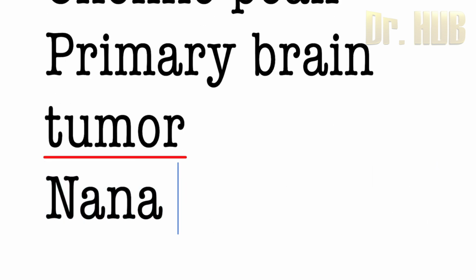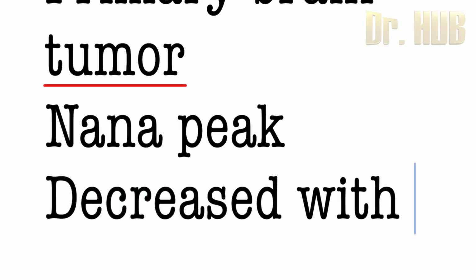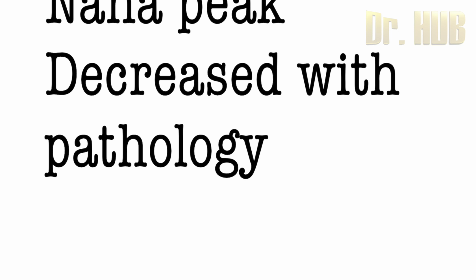Next, it includes an NAA peak. The NAA peak is decreased with pathology, and the normal brain parenchyma has an NAA peak.